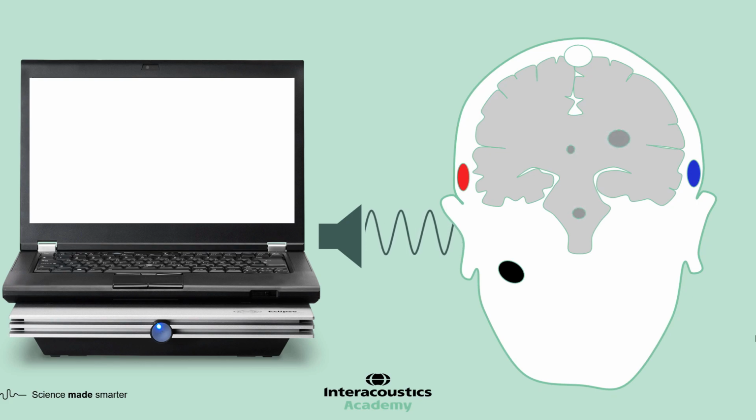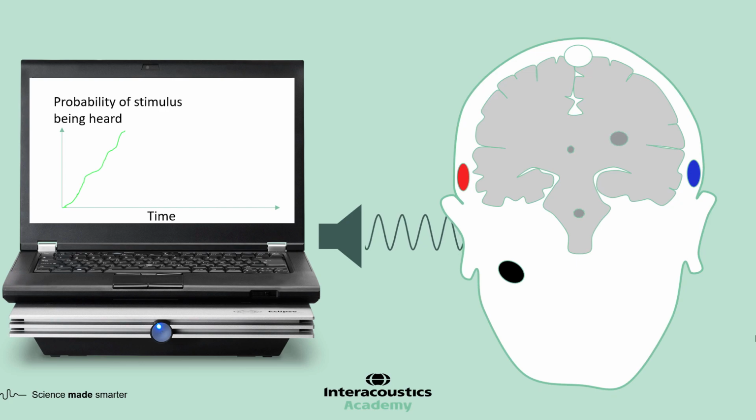to the ear. The modulation of the stimulus can be achieved by changing the amplitude, the frequency, or both. In this example, amplitude modulation is shown. The evoked potential device records this activity and averages the response over time.